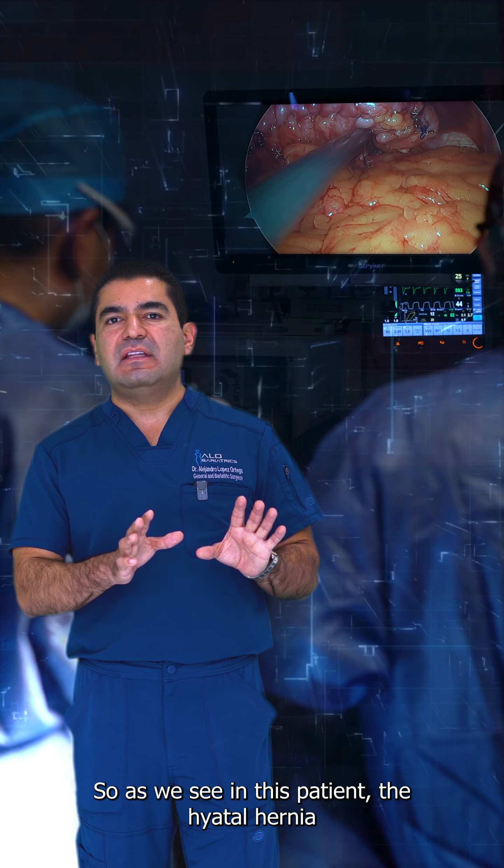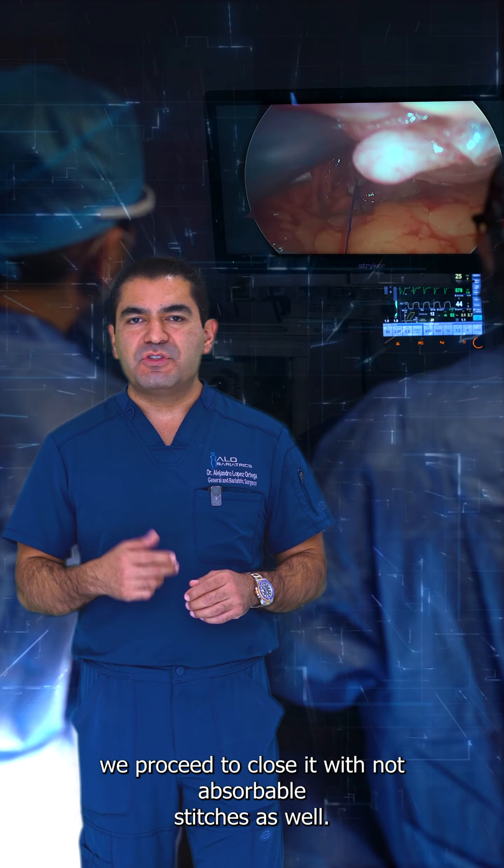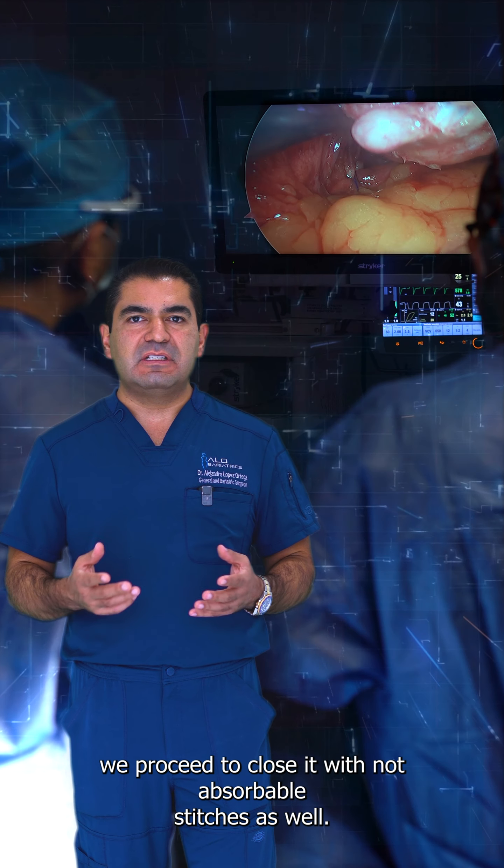As we see in this patient, there is a hiatal hernia, so we proceed to close it with non-absorbable stitches as well.